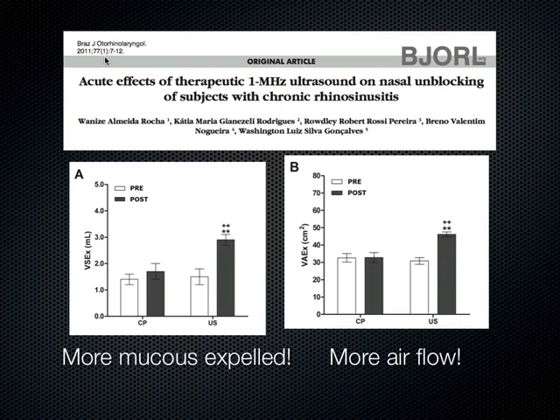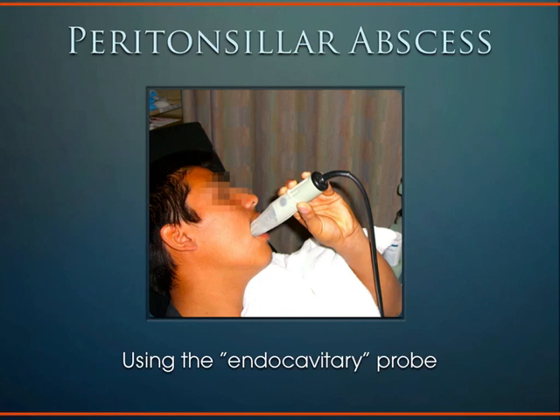It was published somewhat recently in 2011. A lot of this stuff requires, obviously, more research, but this is something that I found intriguing when I first found out about this, that you can actually use ultrasound not just diagnostically with the sinus, but therapeutically as well. Switching gears, and we're going to talk now about peritonsillar abscess.